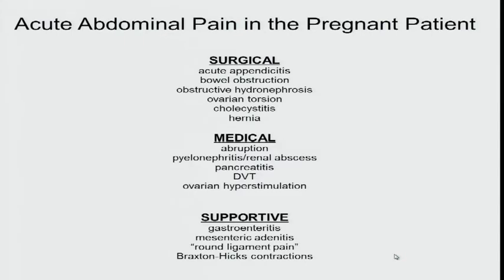First of all, whenever you're looking at studies, when you see a CT or MR for abdominal pain, you're dealing with an acute abdomen. You need to have in your mind, for the age group that you're looking at, what are the most common things, because you're going to want to start there first.